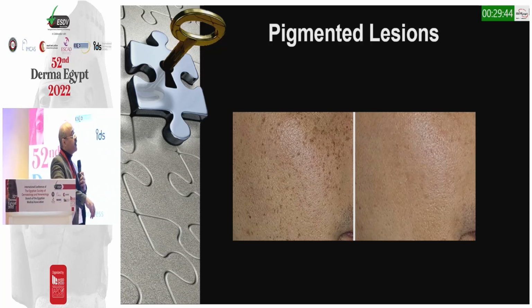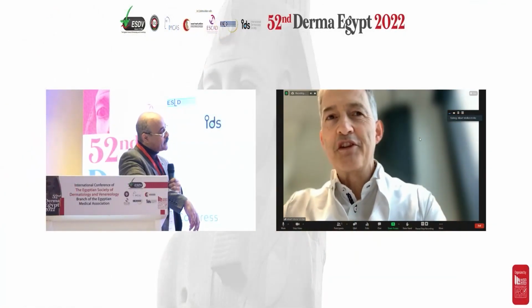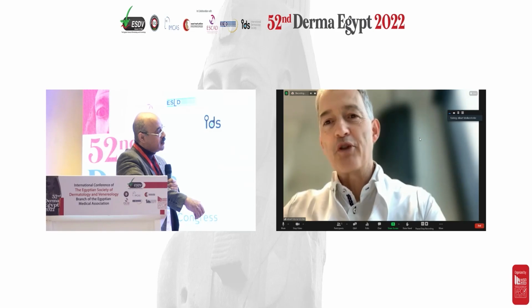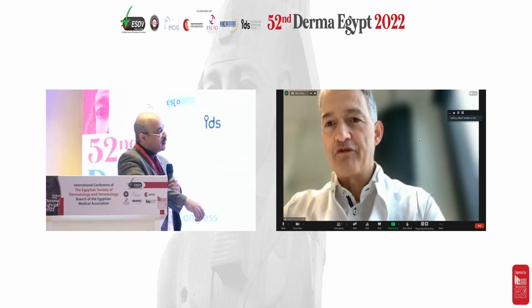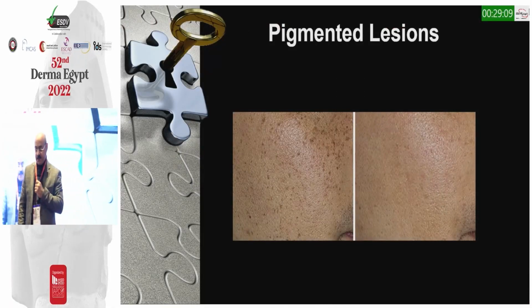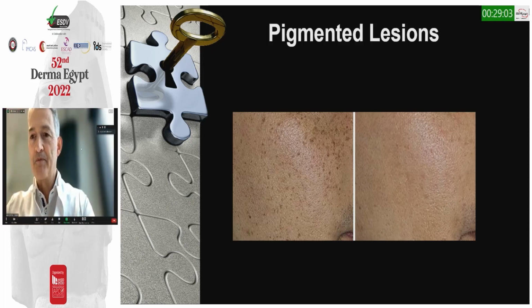So for pigmented lesions in dark skin, Albert, from your experience, what are the most successful pigmented lesions in dark skin which can be treated with laser? Certainly lentiginous lesions and freckling. That's easy, these epidermal lesions. Some lesions tend to recur, and that is a problem for any type of laser device, but it really depends on the pigmented disorder itself. Do you use the ablative lasers, Erbium-YAG or CO2, or the Q-switched lasers for those? In fact, I use only the Q-switched lasers for pigmented lesions. Okay, perfect. Peter, do you have anything to add?